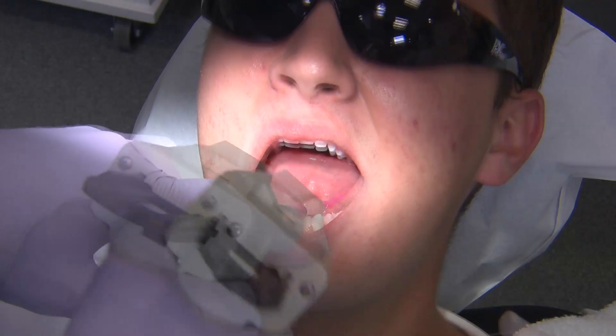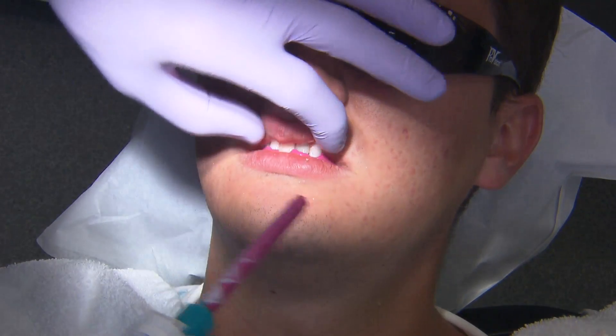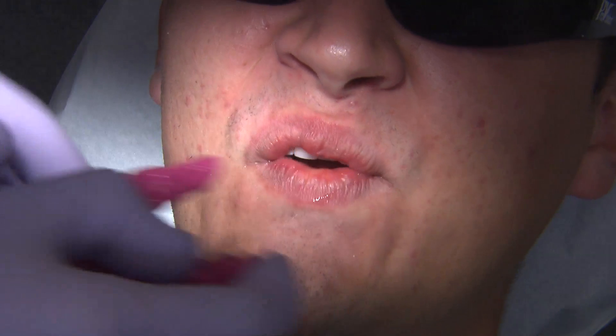We take a bite registration and opposing arch impression so that the laboratory can fabricate the final restoration for the patient.